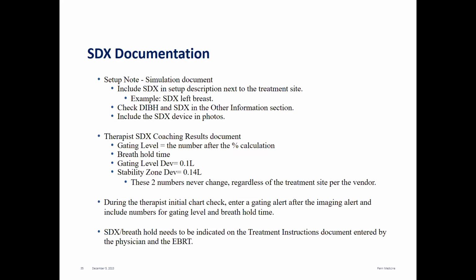The therapist will enter the SDX coaching results in that encounter as well. There's an SDX coaching results tab. So you're going to put that gating level in. That's the number that you got after you took the percentage calculation from that average. You'll do the breath hold time.